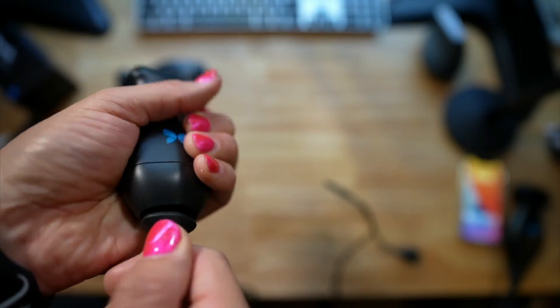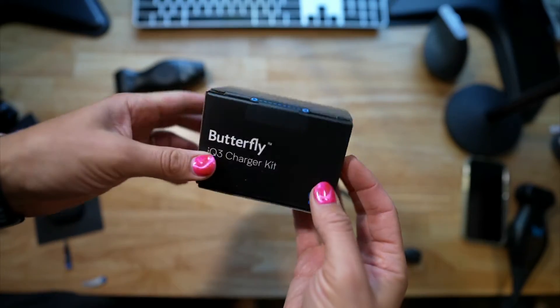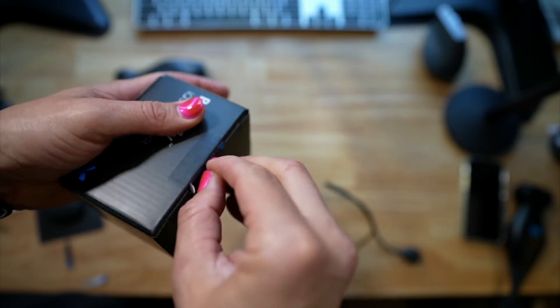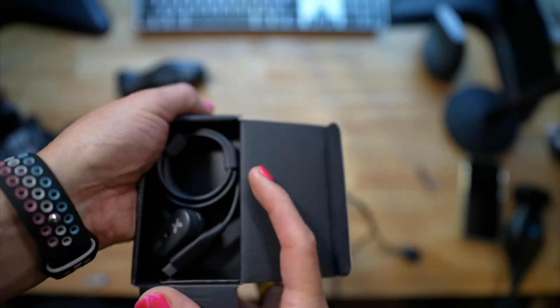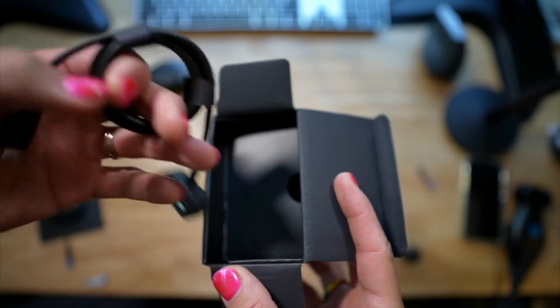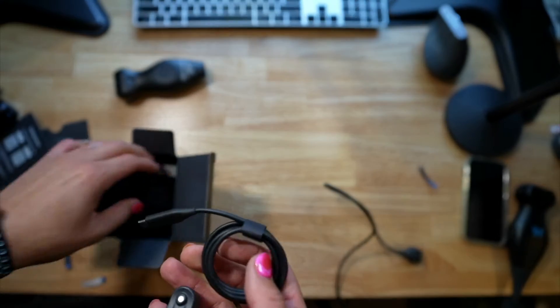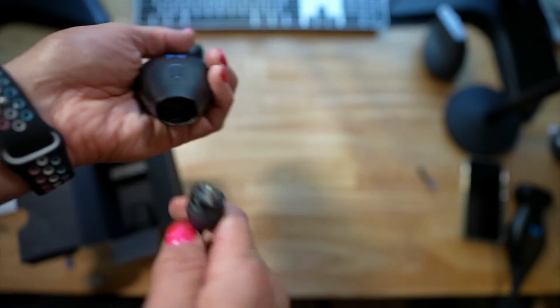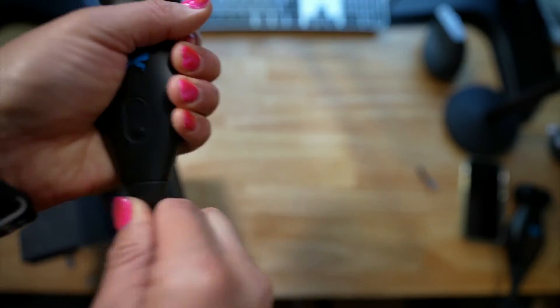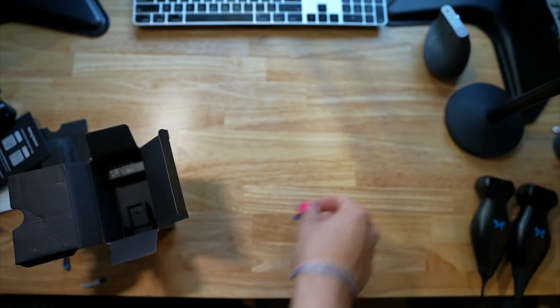We also got a charging kit — let's see what's in there. It looks like the wireless charger, which is quite a different form factor relative to the old charger for the IQ Plus, the penultimate edition.